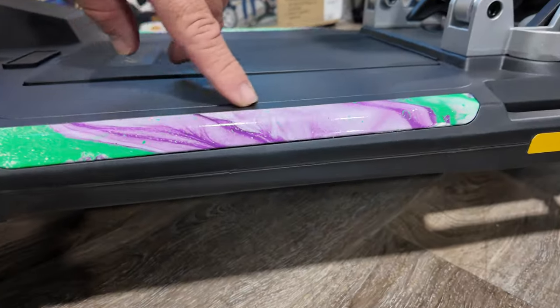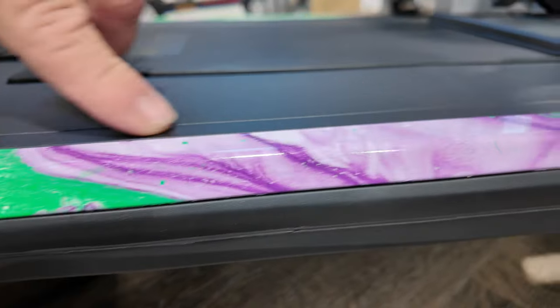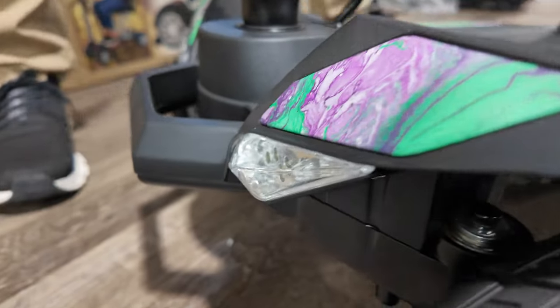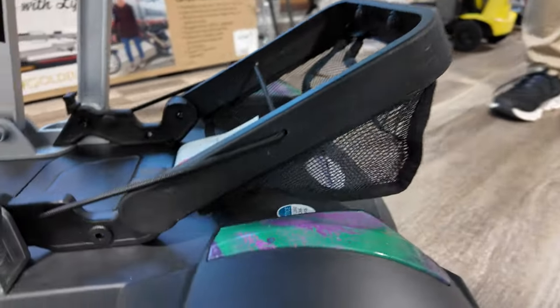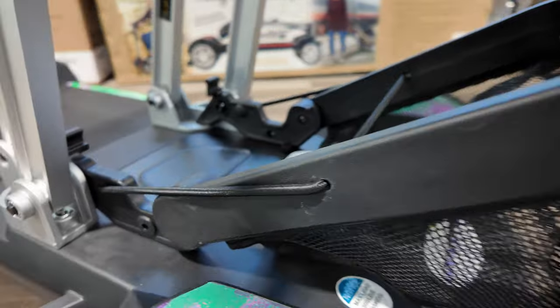Customized, favorite color — purple and green for this customer. This thing is really cool, and there's no other GB120 TSA anywhere that looks like this.